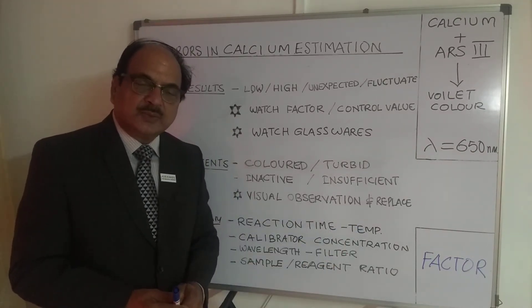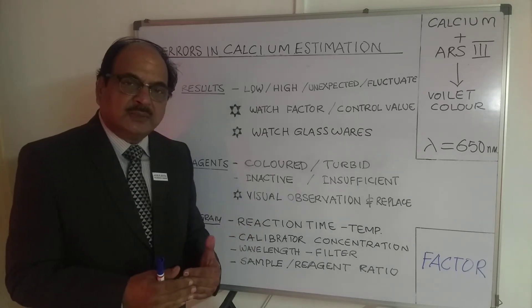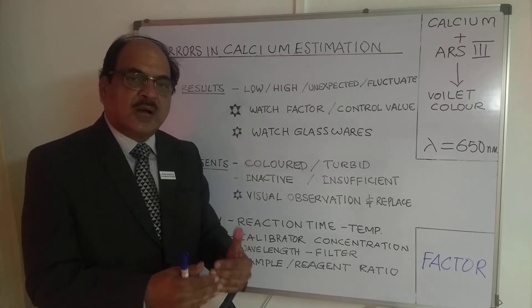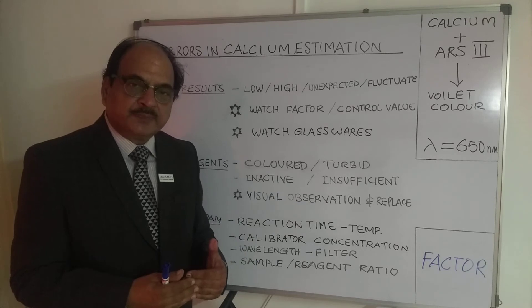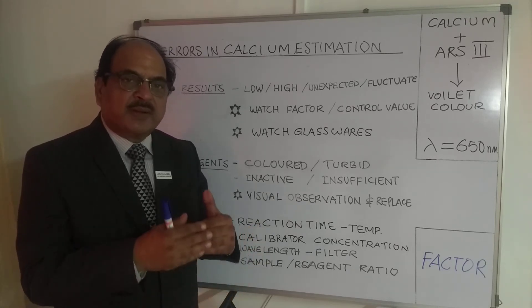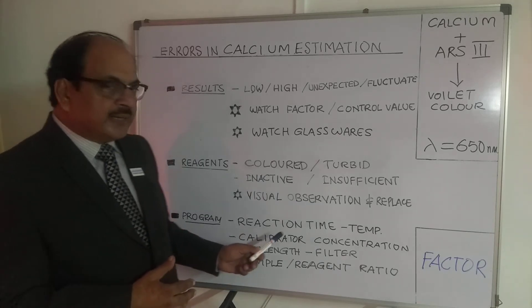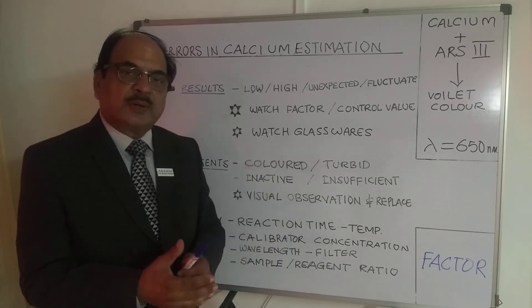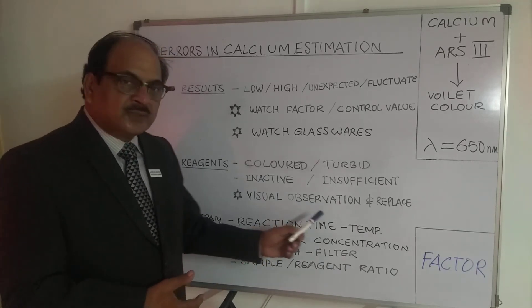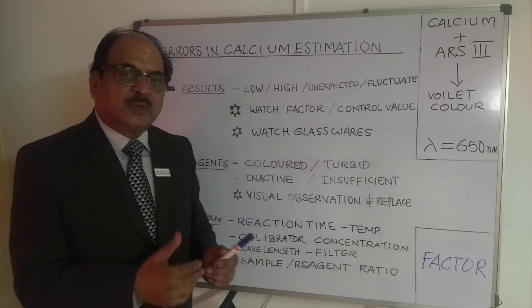Now let's discuss program-related errors. Reaction time and reaction temperature are critical issues, but as far as calcium arsenazo is concerned, the reaction time is very fast and whether the reaction is at 37 degrees or room temperature doesn't make a significant difference — it reacts quickly to give a purple color. Since the color is stable for one hour, ensure that you take your absorbance reading within that period.